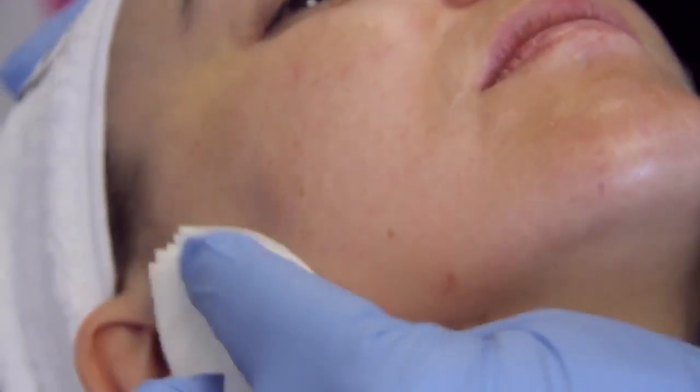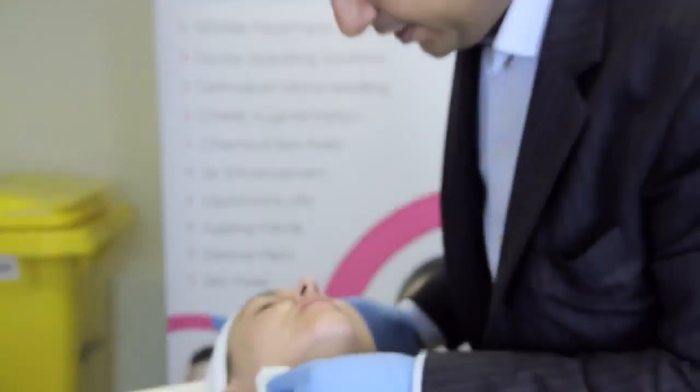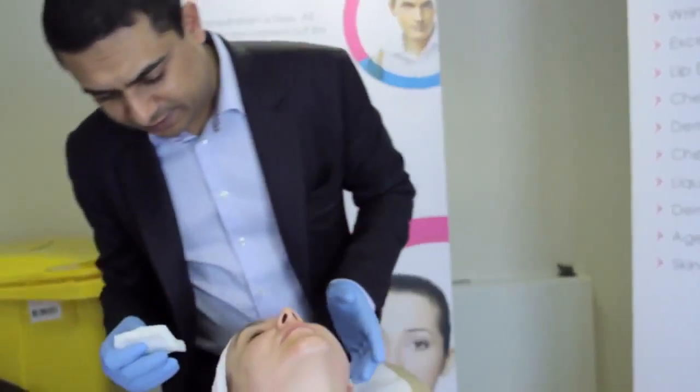We're just going to clean away the area. Some aftercare advice, Hayley: no exercise today, no alcohol, and don't bend down or lie down for three to four hours. We're just going to wipe away the excess blood and the markings. As you can see, there's no trauma, bruising or bleeding.